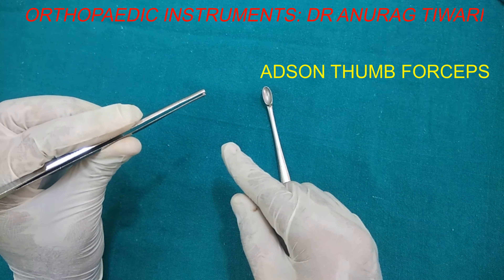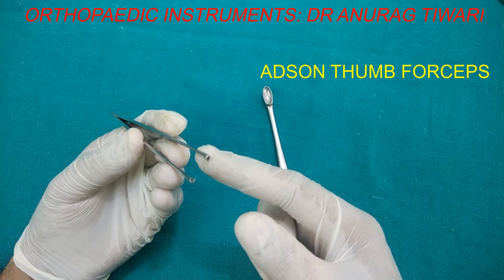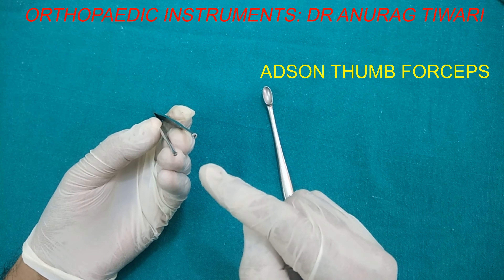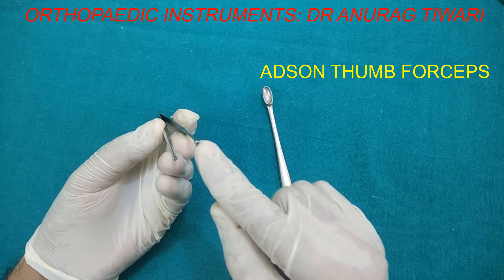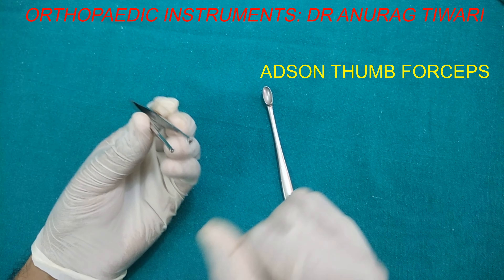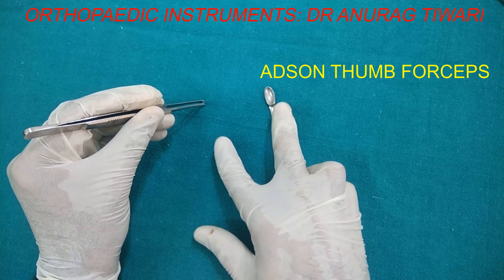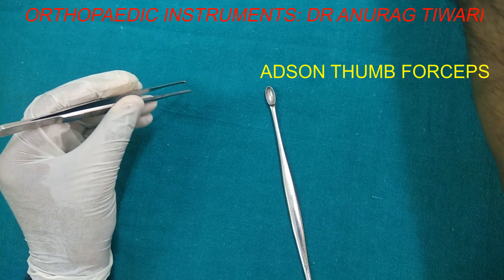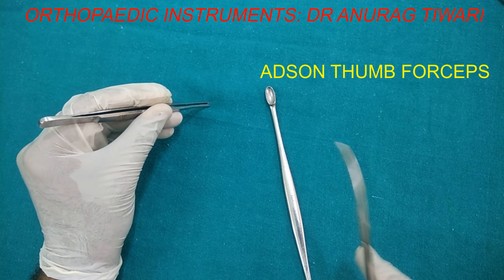That covers all the different pins used in orthopedic surgery. Next I will show some instruments that look almost alike.